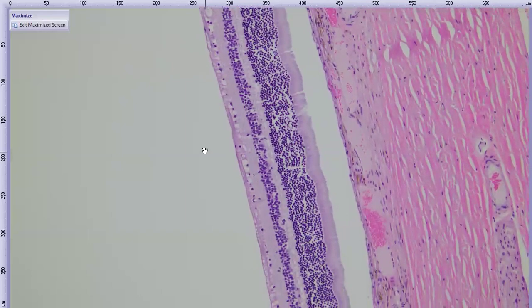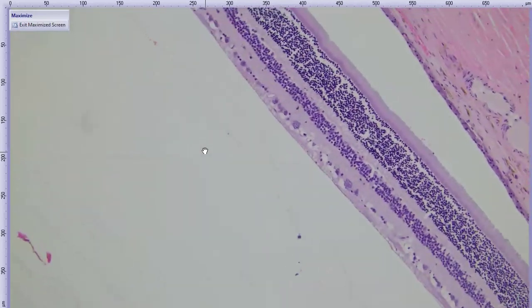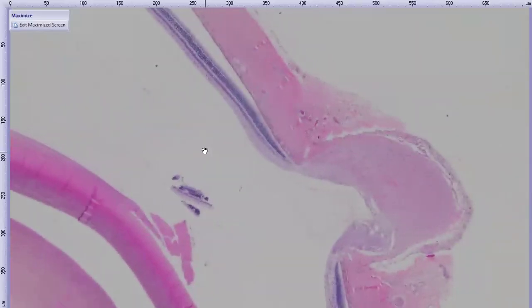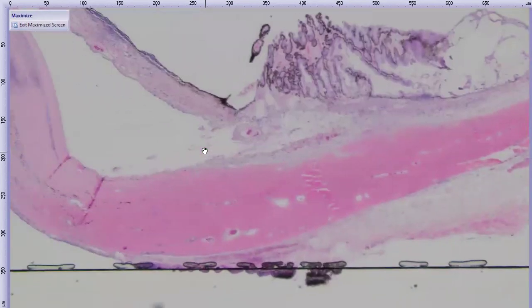It's usually just mostly what we see is loss of the ganglion cells, maybe a little bit of cupping. Here on the dorsal side, it's a little bit spared because they're still here. So we also have to answer what is causing the glaucoma question in this cat.